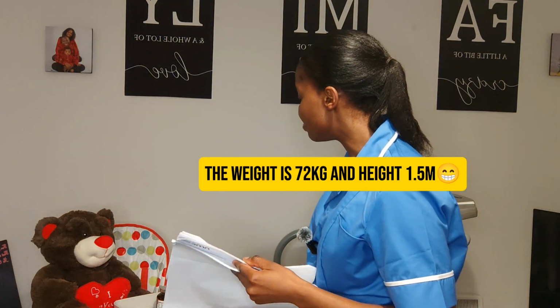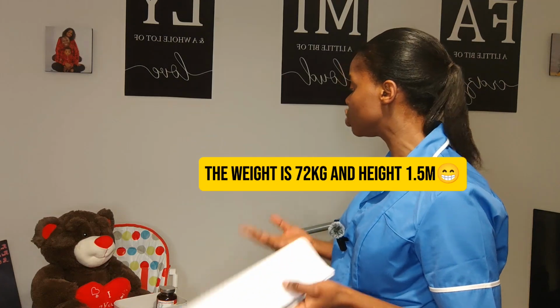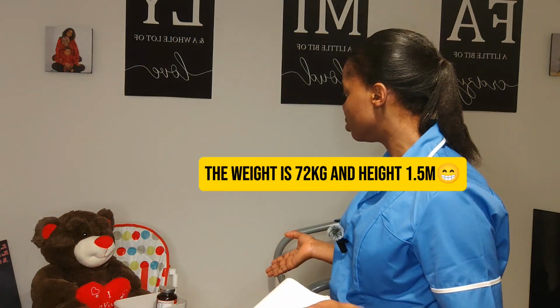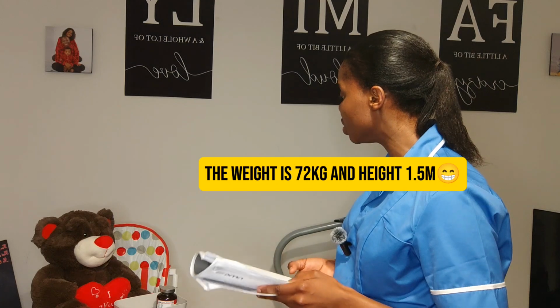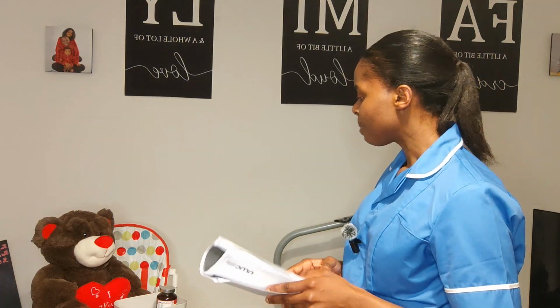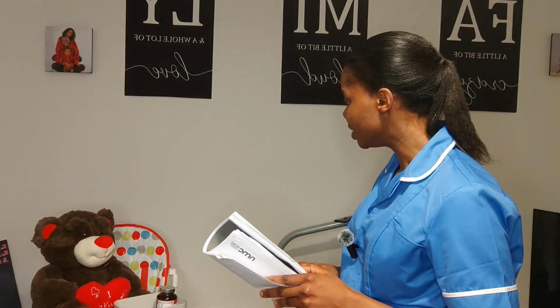All right, Janet, what salbutamol does is facilitate proper breathing for you, to make you breathe at ease, because the way you are breathing now is not okay with us. So we want you to be much more comfortable. Some of the side effects you may or may not experience include, and are not limited to, lightheadedness, headache, or dry mouth. Are you still happy for me to continue, please? All right, thank you very much, Janet. So I'm going to be stepping aside now to prepare the medications. Is that okay? All right, thank you.